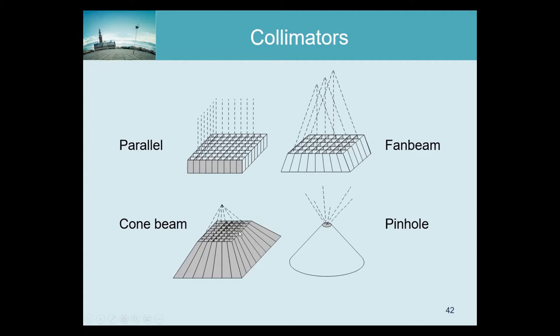Also, the planar projections of cone beam are much more difficult to interpret, because they create significant deformations, and the image made by a distribution depends heavily on the distance of that distribution to the detector, which complicates interpreting the image.